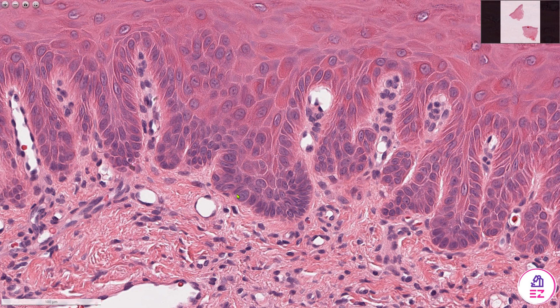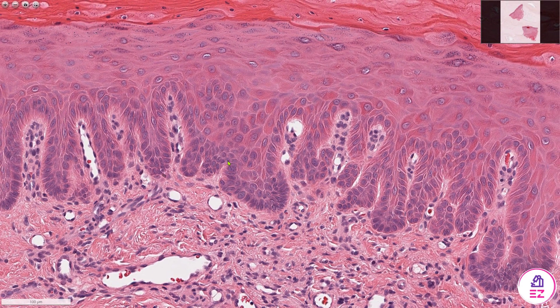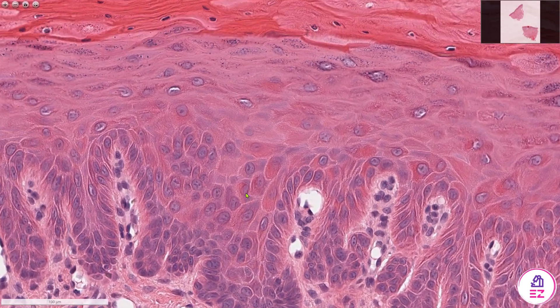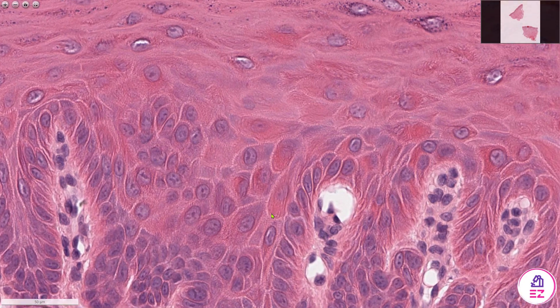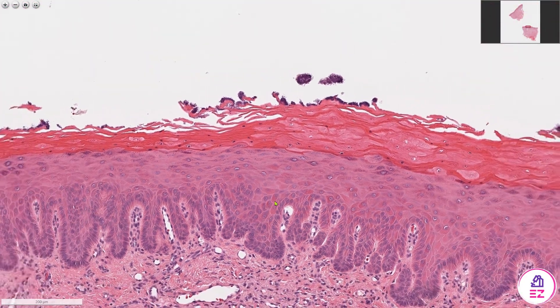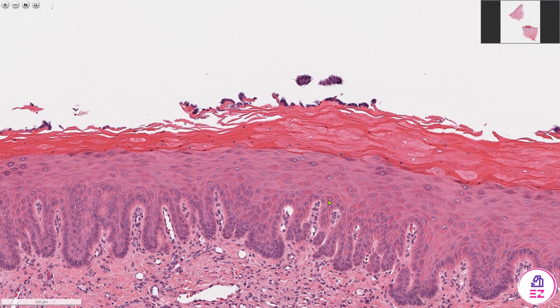This particular case doesn't seem to have any mitoses, at least not in the field I'm looking at now, but that would be another thing to look for. As well as the nuclear pleomorphism and increased nuclear to cytoplasmic ratio, there are these cells here which are kind of pinking up — they're showing a degree of dyskeratosis. They haven't quite formed keratin yet, but on low power you can see quite a few of these cells around, and they also have quite a prominent nucleus.